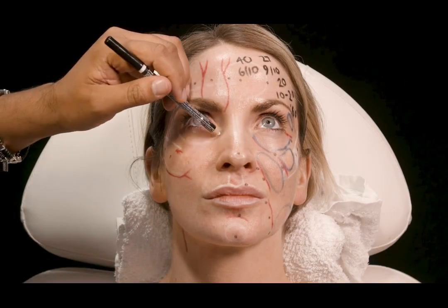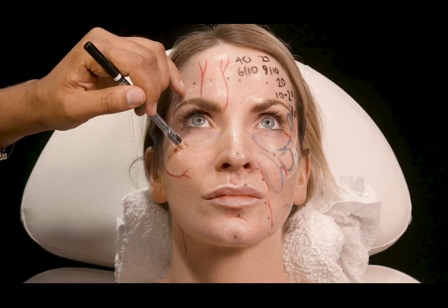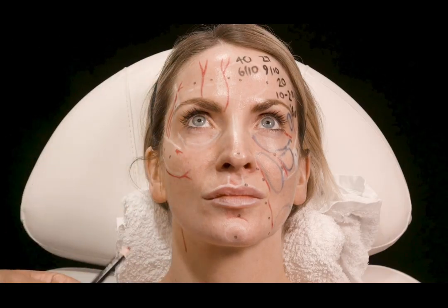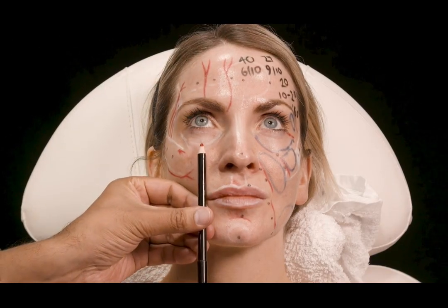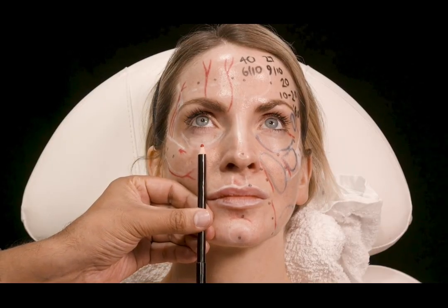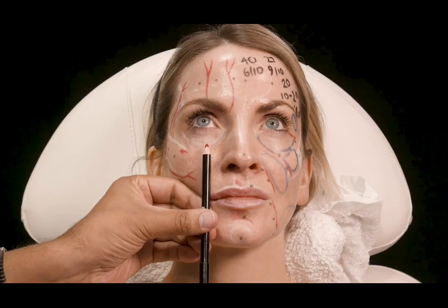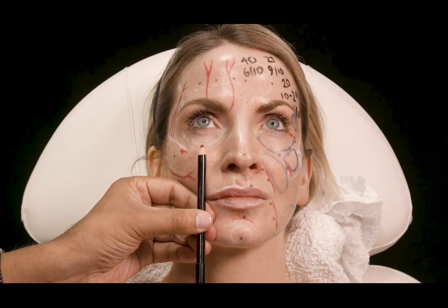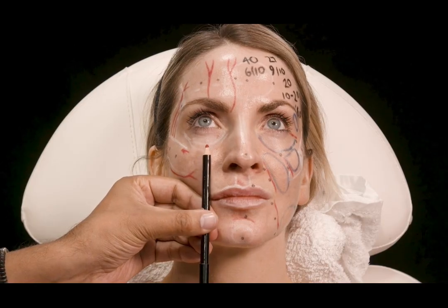Then the lid cheek junction, right here. And 1 centimeter below the infraorbital rim, this is the midpupillary line. This is the medial limbic line. It's the inner aspect of the pupil. So midpupillary, medial limbic. You see the difference?